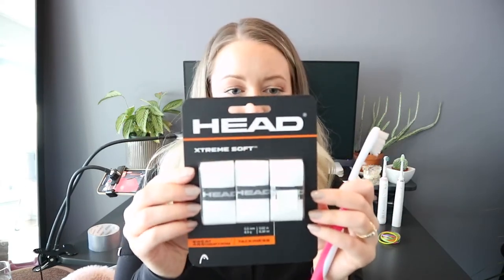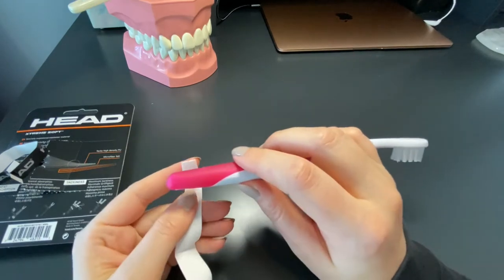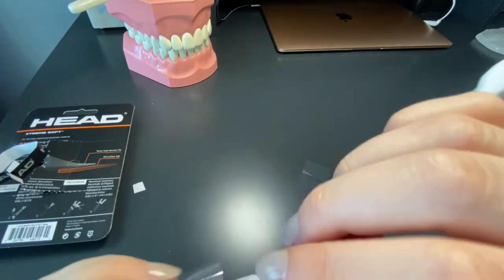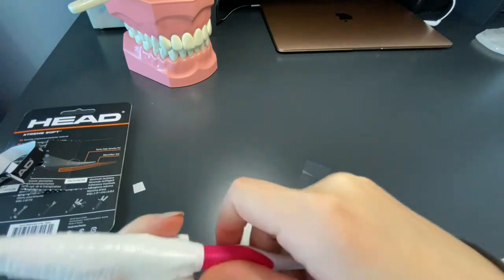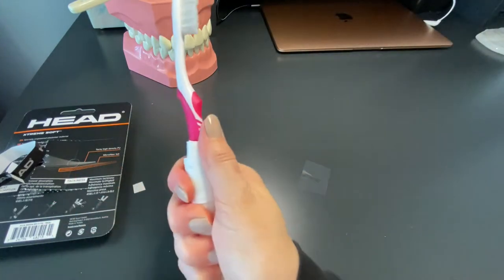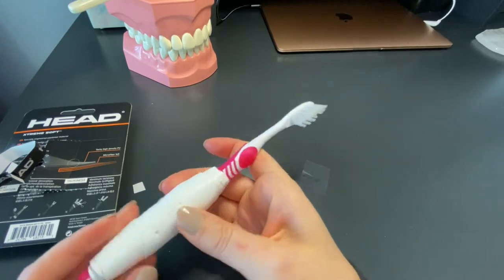The next way to adapt your toothbrush handle is to tape around it. Tennis racket tape is really nice — it has great grip and works really well. Start at the bottom of the toothbrush and add as much as you want to make it as thick as you want. It's really cushy and soft on the hands, and you can rinse it off really nicely.